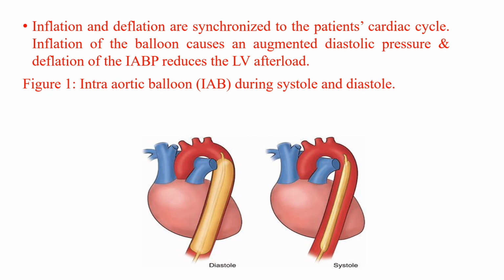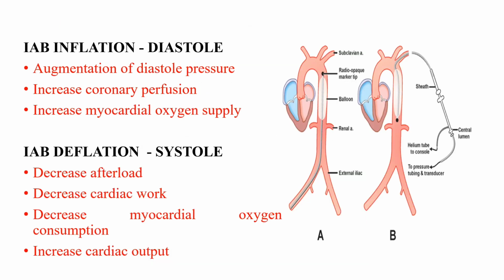What is inflation and deflation? Inflation and deflation are synchronized to the patient's cardiac cycle. Inflation of the balloon causes an augmented diastolic pressure, and deflation of the intra-aortic balloon pump reduces the left ventricular afterload. So here you have the picture. You can see the intra-aortic balloon pump during systole and diastole. We'll see intra-aortic balloon inflation in diastole and deflation in systole.